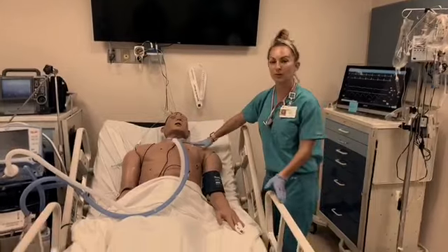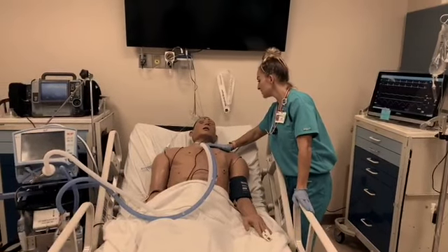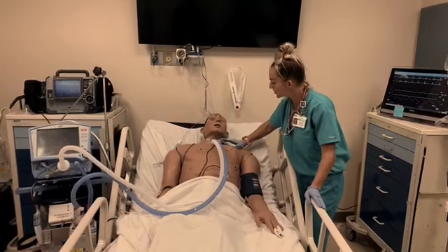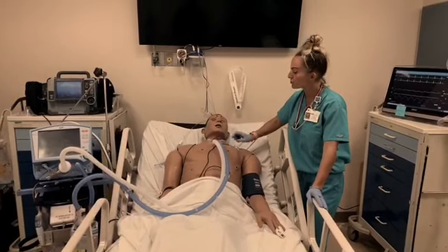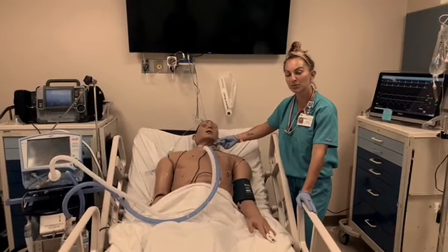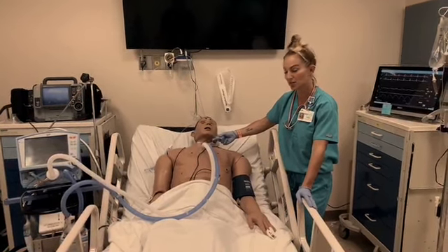what we're first going to look for is the placement. Make sure the cannula is intact, it has not been dislodged, the dressing's in place. We're going to make sure that the cuff is inflated. You can check that by this bag here. You want to be able to push it. It should be firm to the touch.